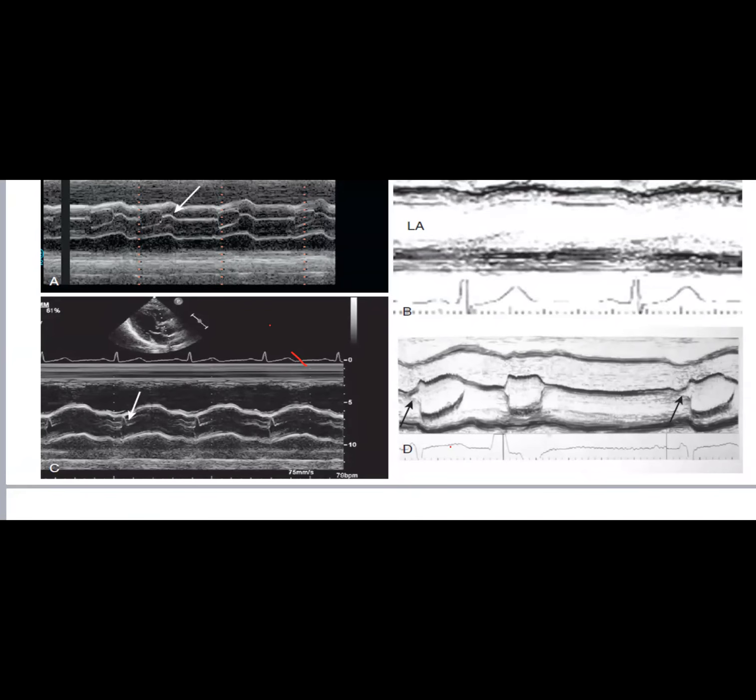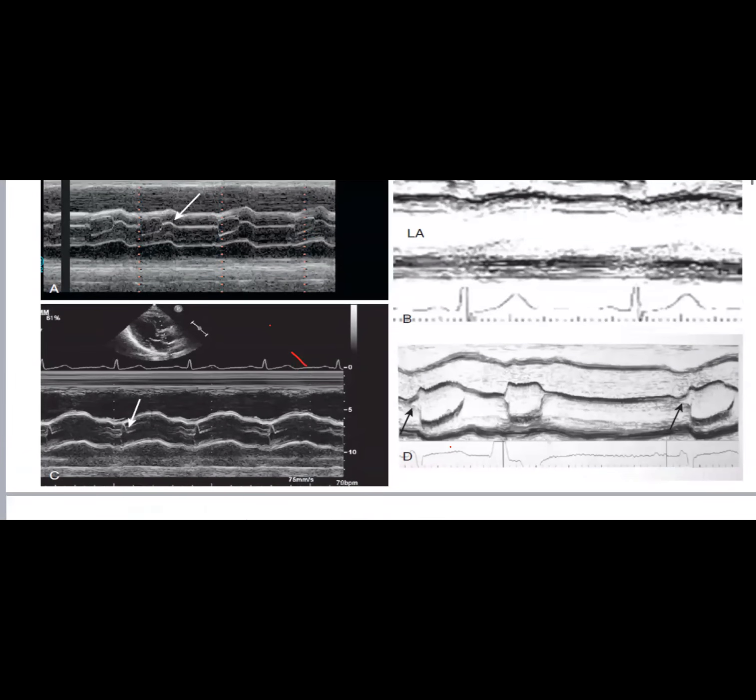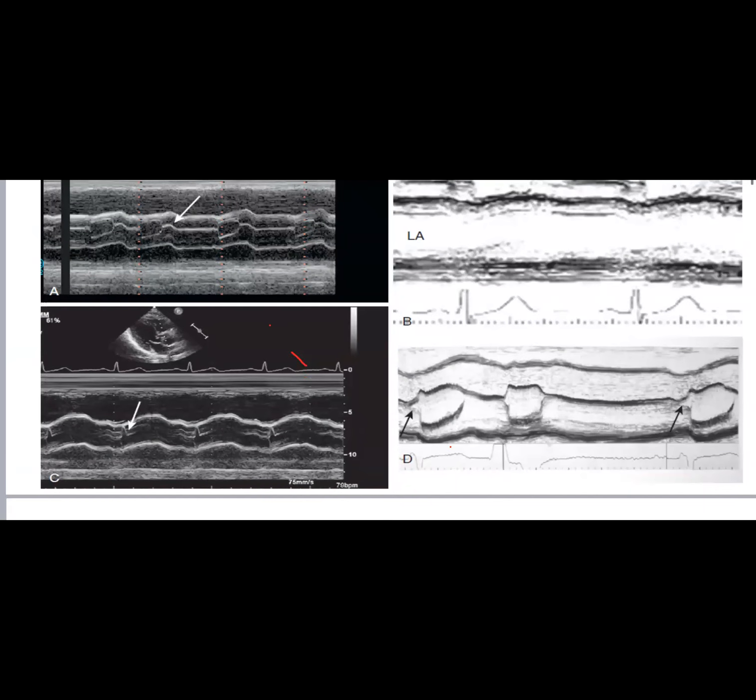What you see in here, if I can schematize it for you, it does look like this. So something going up, and it goes like this and then like this. So instead of going this way, something goes up, then it closes early, then it opens again.